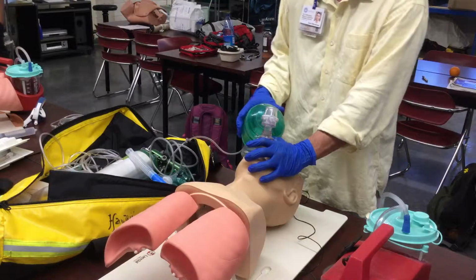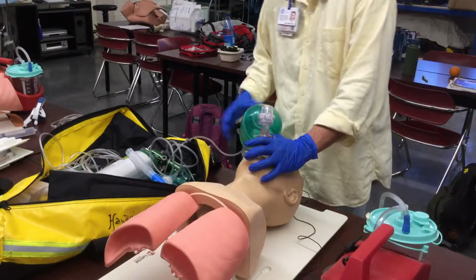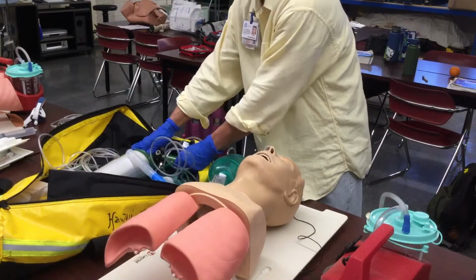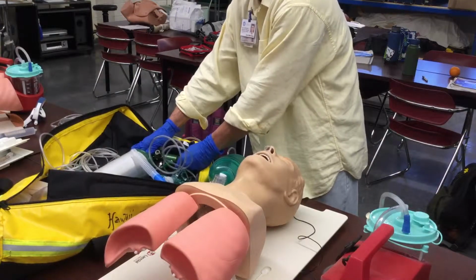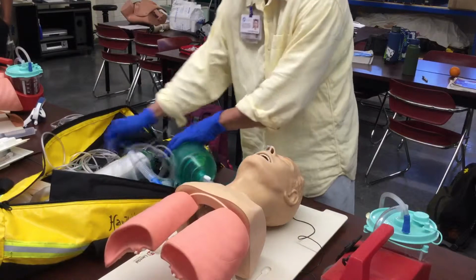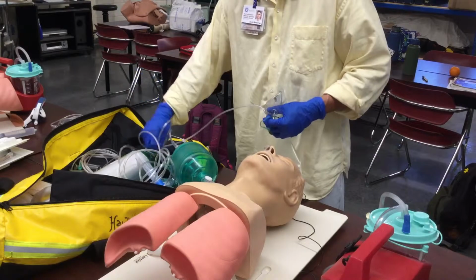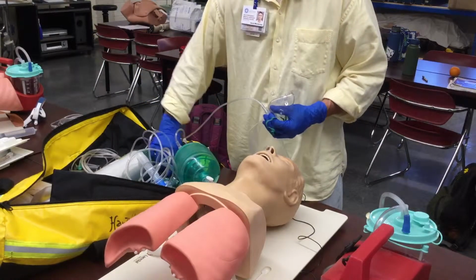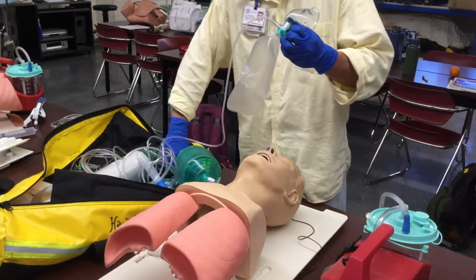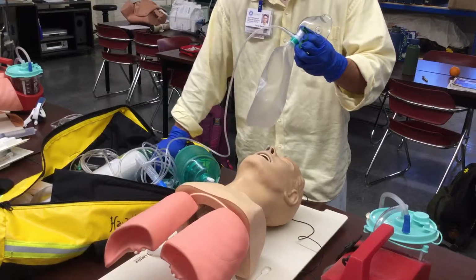So now my patient is arousable and probably doesn't want the mask and is not tolerating this positive pressure mask, and doesn't like the nasopharyngeal airway. I'll go ahead and continue placing the patient on supplemental oxygen. I could choose nasal cannula or a non-rebreather mask at this time. I guess, what is the SATs at? 93%. 93, so that would indicate that I would want to do a little higher flow, 15 liters.